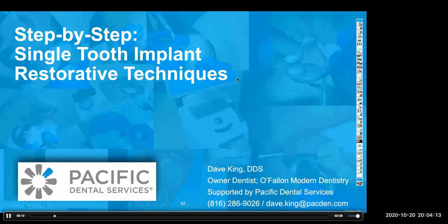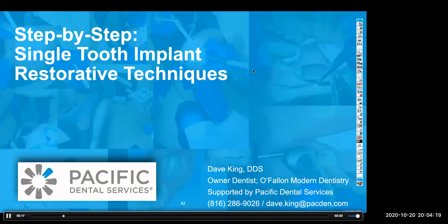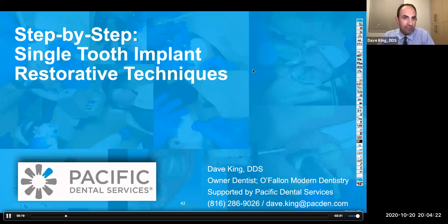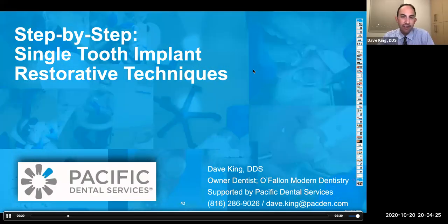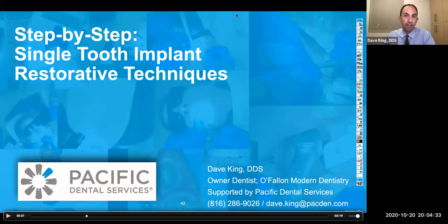Here's one. If you're replacing a canine with an implant and the patient had previously canine guidance, how do you deal with that? So I'd probably transition him to group function on that side. And I think it's mostly about making sure that we're managing the guidance so that we don't compromise the long-term outcome of the implant. My worry would be with an implant in particular, on a canine, the lateral forces, like I mentioned, will cause over time a flex, and you'll either get a loosened implant screw, which we can deal with pretty easily, or you'll get a fractured abutment or crown or loss of the implant. So it's worthwhile considering transitioning them to a group function on that side.